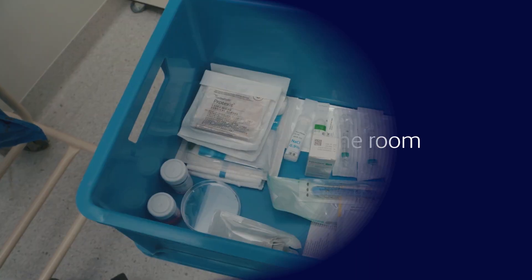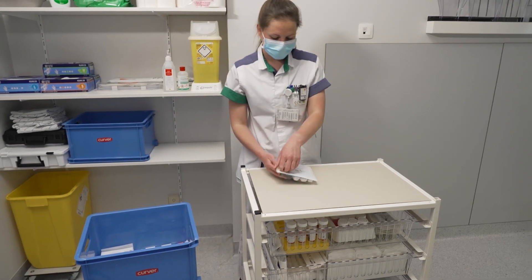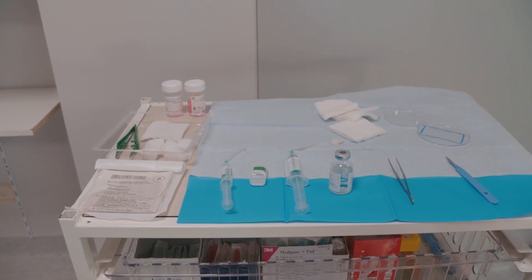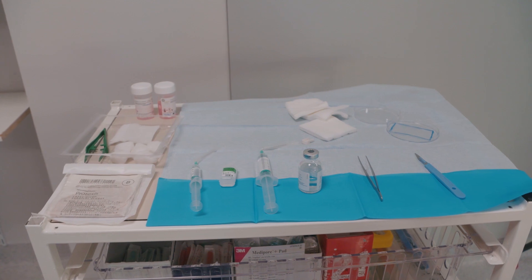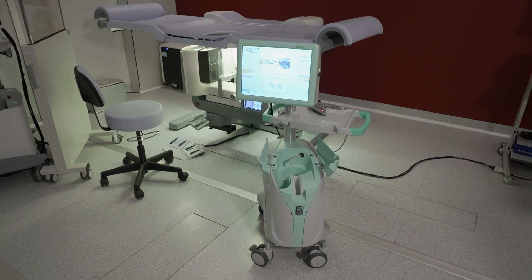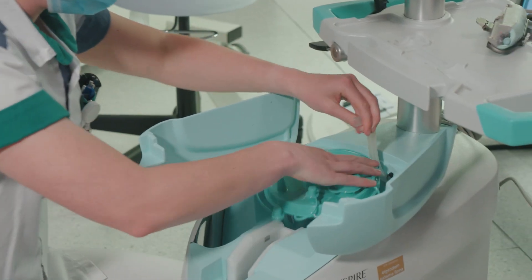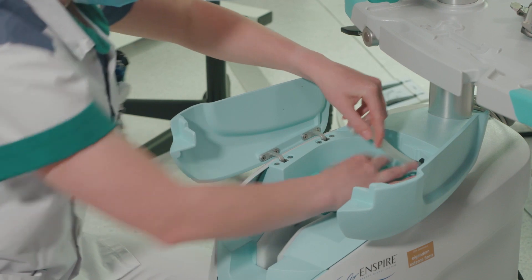All materials needed for the exam must be prepared in advance. The EnCor Enspire system must be prepared for the procedure. The EnCor Enspire console is set up with the canister, cassette, and saline.